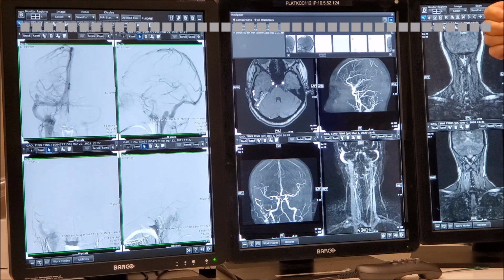So you take a deep breath in, blow it all out, take a deep breath in, hold your breath. If you just say hold your breath, you may get the patient in half inspiration, half expiration. But if you do the exercise, in and out, and then in, and then stop, it works. You get a much better picture. You're going to have a little bit of a hard time with this patient.